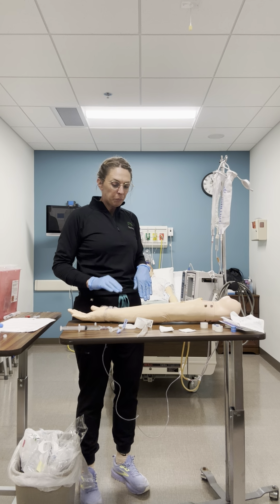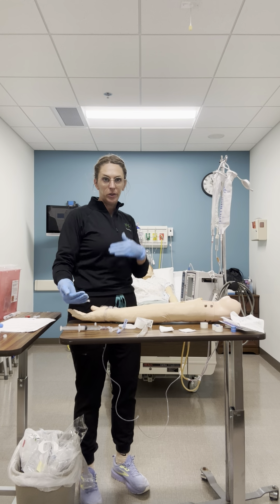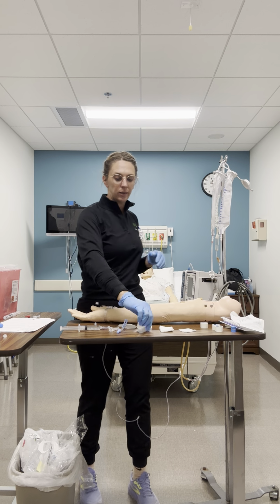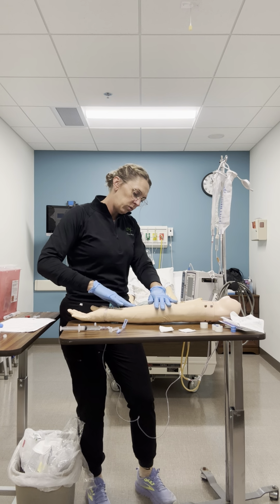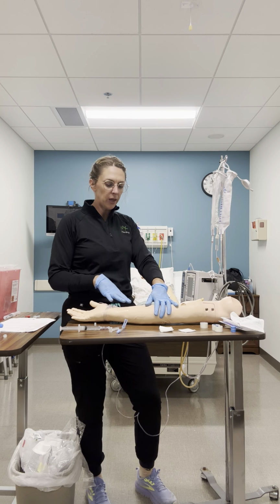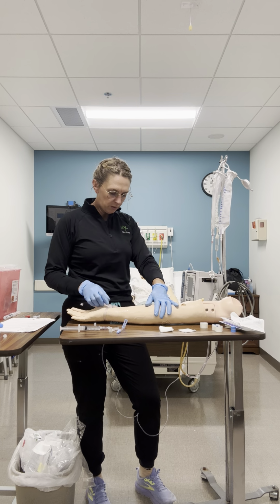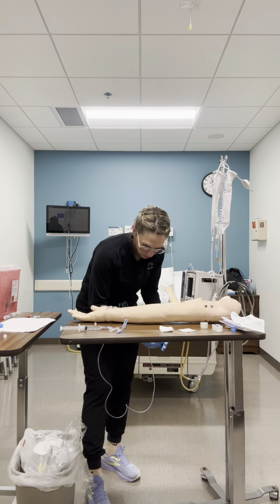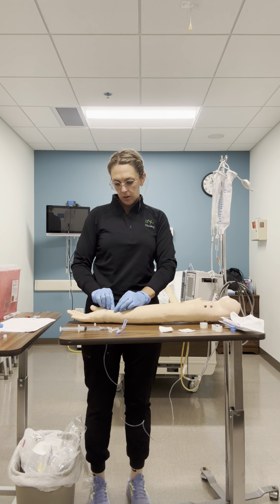At this point, I'm going to shift to moving from an IV to a saline lock. So I would make sure that I have all of my supplies to do this next skill. And then I would come in, I would assess the site, the IV site, and make sure that it looks okay. There's no signs of infiltration or infection, and it looks good here, which is wonderful. So I'm going to pause that, and I'm going to make sure my tubing is clamped, and it is. I'm going to hold the port.